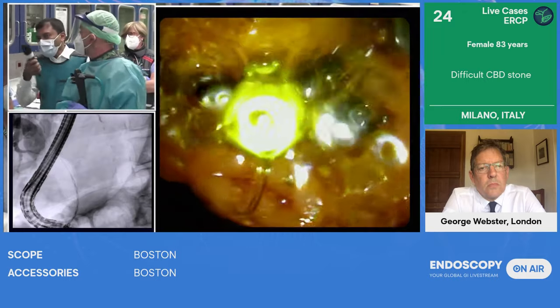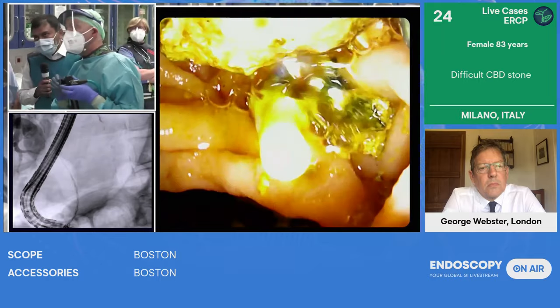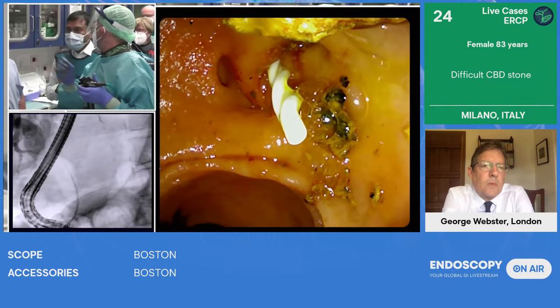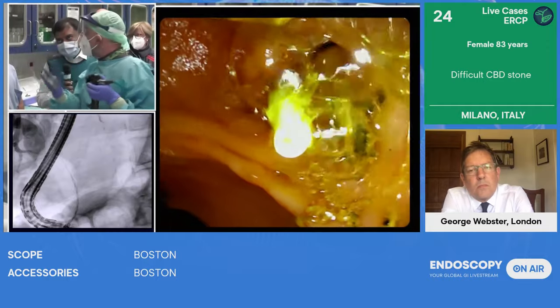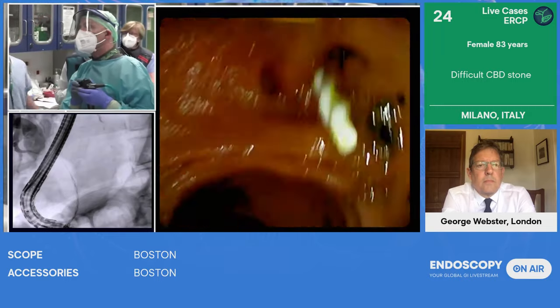And how long will the stent be visible on X-ray? At least, in more than 90% of the cases, you will see the stent for 3 months. Then it will start biodegradation. But because it does the drainage also from the outside, it is always working for this condition. So we are very happy.